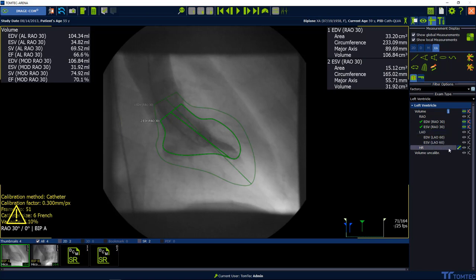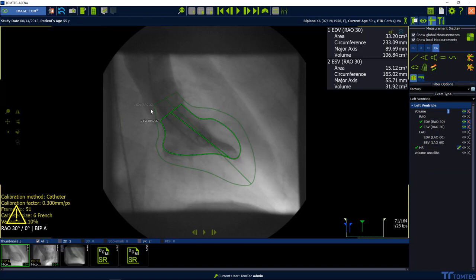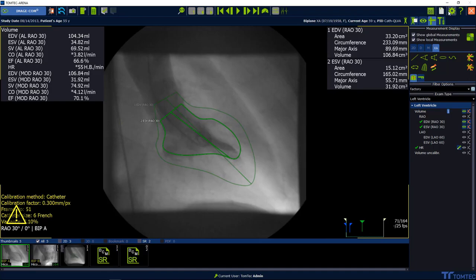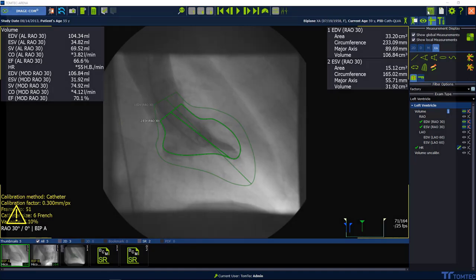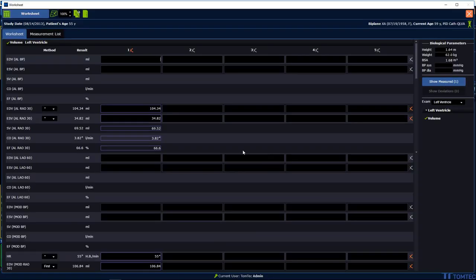Insert the heart rate manually to calculate cardiac output and cardiac index. Save a screenshot by selecting the secondary capture icon in the upper left-hand corner. All values can be visualized in the worksheet — select the launch worksheet button in the upper right-hand corner.